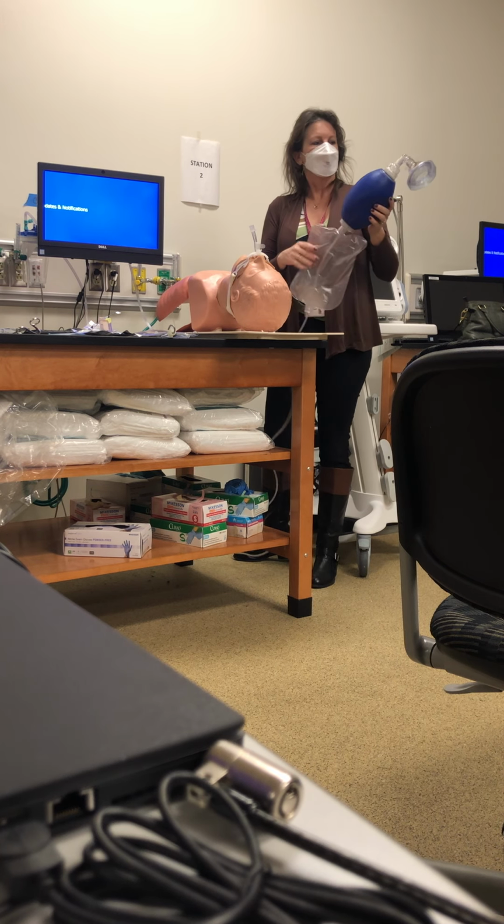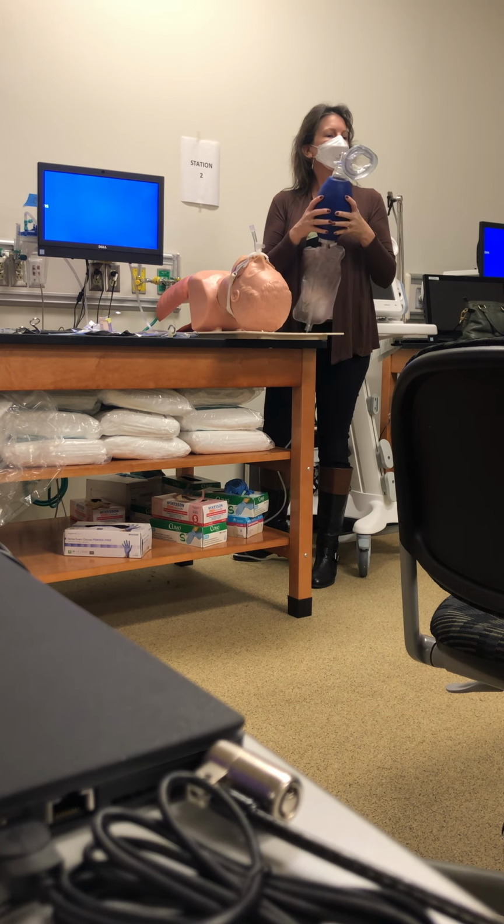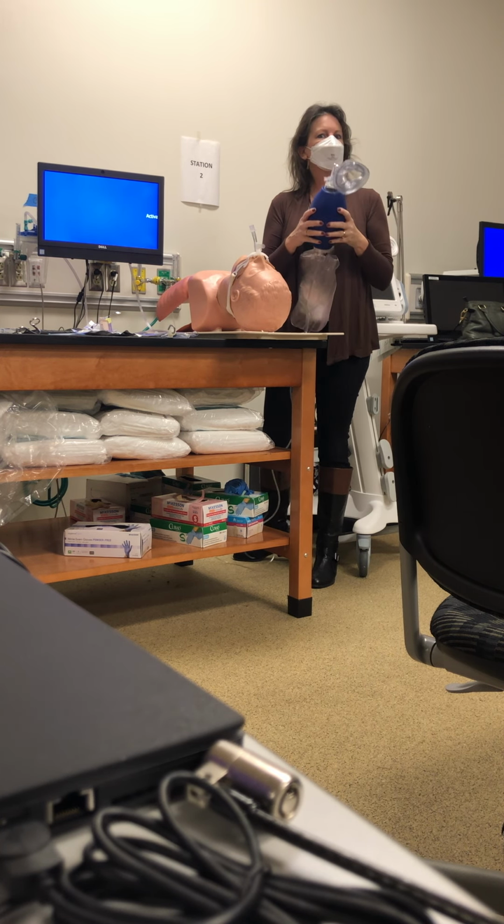Okay? If you came into the room and a nurse was bagging, don't just take over without looking at your connections. All right? Lots of times, somebody might hook it to here by accident. I've seen it many, many times. And that's your responsibility. You're covering the airway. So make sure you're hooked up to oxygen.